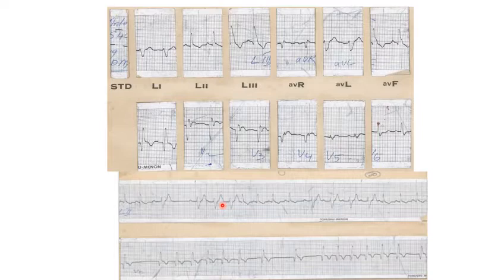Can you tell me a few electrocardiographic patterns which will make you think that the patient is having a trifascicular block? For nine of them there, at least tell four or five. Bifascicular block, RBBB plus LAHB plus increased PR interval. Okay. Or RBBB with left posterior hemi block, meaning right axis, along with increased PR interval. Okay. Sir, then complete left bundle branch block with increased PR interval.